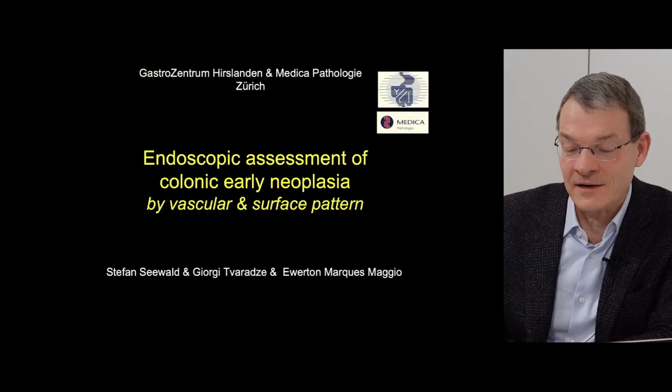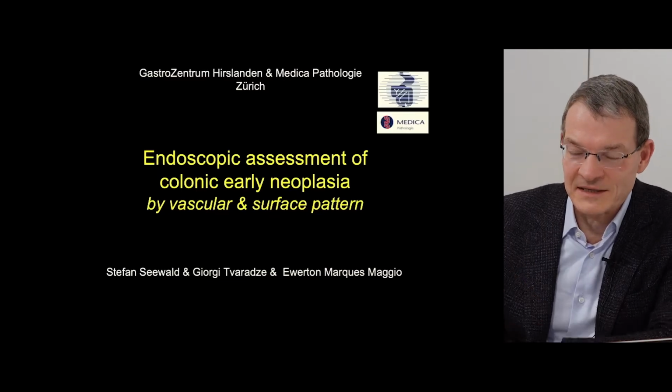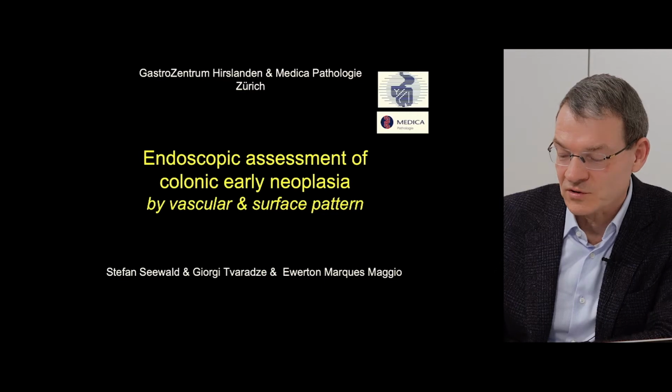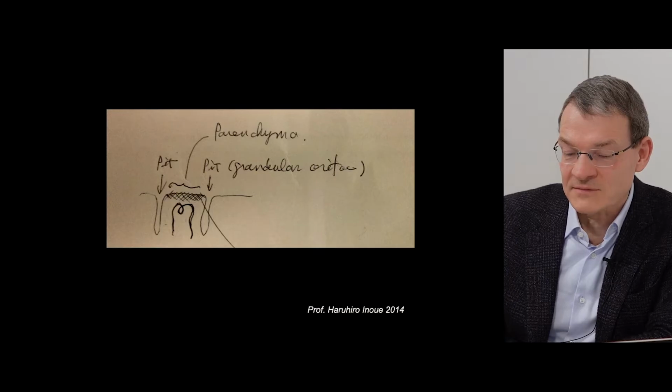Okay. So I think in Europe anyway, we have the problem a little bit that we are not that good like the Japanese in endoscopic assessment of early neoplasia in the colon. But I think we can catch up and we can only get nice results with imaging. So I think it is good to try to better understand also how we should approach. So what does imaging or endoscopic assessment mean?